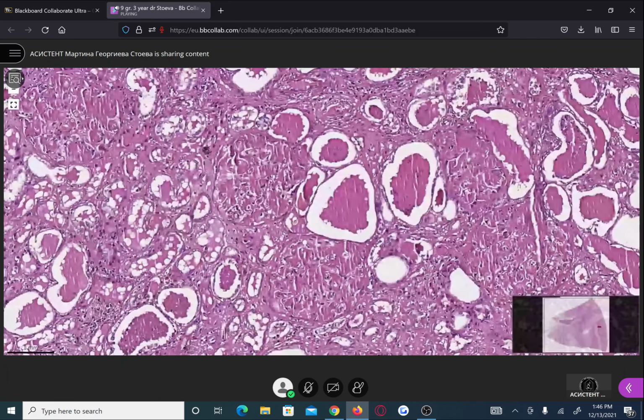Yeah, but the preserved glomeruli, which are not affected by hyalinization, are a little bit hypertrophic to compensate for the lost function. But the hyalinized glomeruli themselves are decreased in size, while the glomeruli that are affected by amyloidosis are enlarged. So here we compare the affected glomeruli.